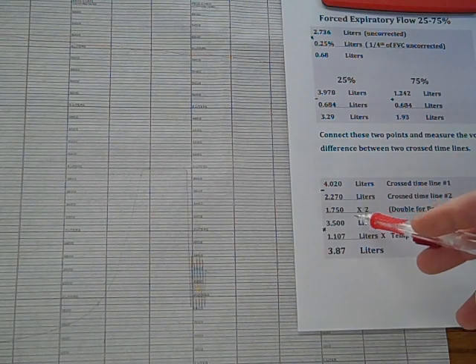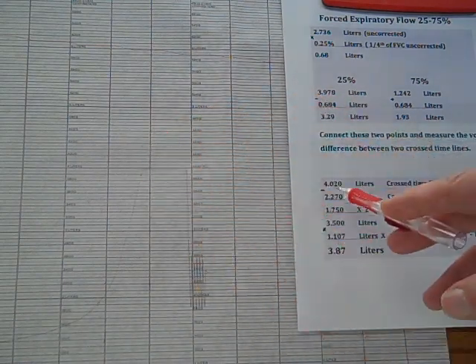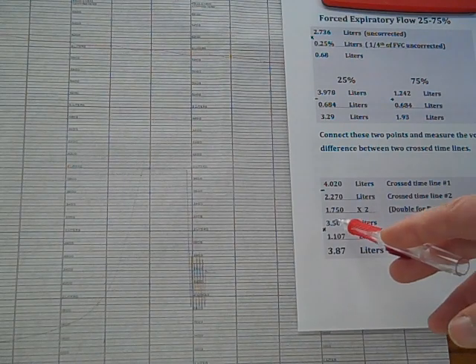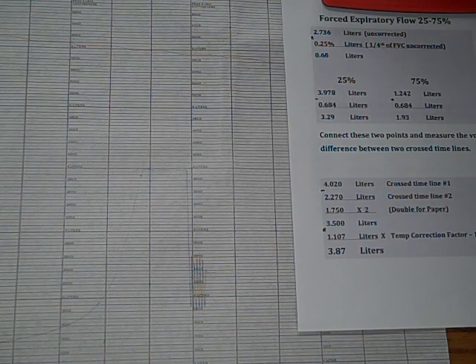When we do that, we end up with it intersecting at about 4.02 on one side and about 2.27 on the other side of the line, giving us about 3.5 liters when we double for the paper and the temperature correction, and we have our 3.87 liters. This gives us an idea of the airflow and the patency of the middle airways.